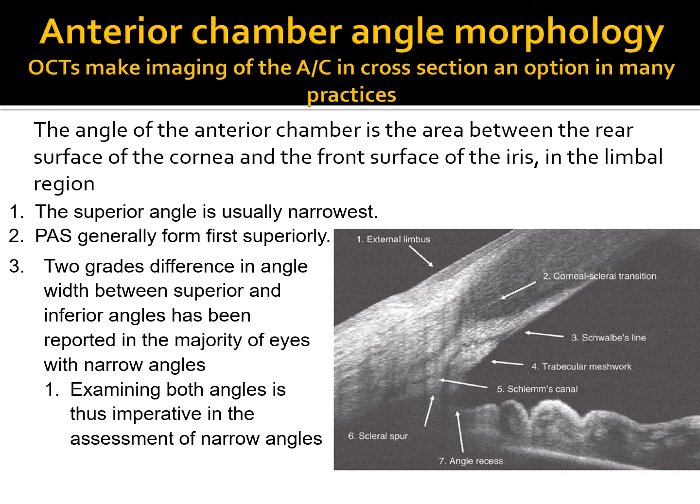And this OCT is a really good photo here. It allows you to really see the structures quite well. For instance, the TM is beautifully demarcated there. And you can see the other structures that you might be looking at with a gonio lens.